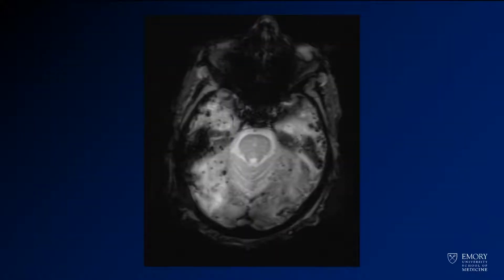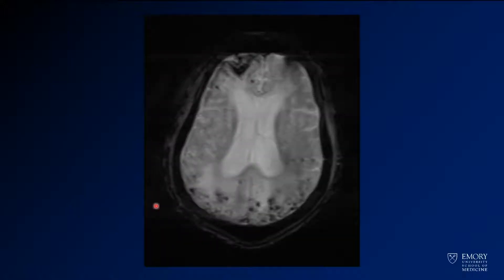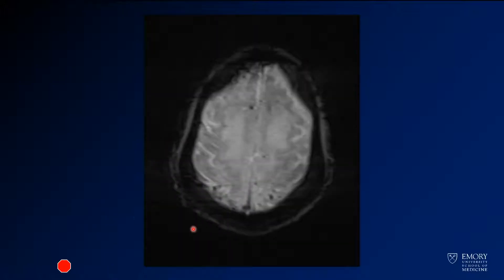Now we start looking at gradient imaging and we start to see a number of abnormalities — numerous little punctate areas of susceptibility. As you go through multiple levels, you're going to see many of these peripherally located areas of susceptibility. Here you see greater susceptibility in an area where there's probably more acute hemorrhage than we saw on the CT. As you come higher, you just see more of the same, with multiple cortical-based areas of susceptibility.